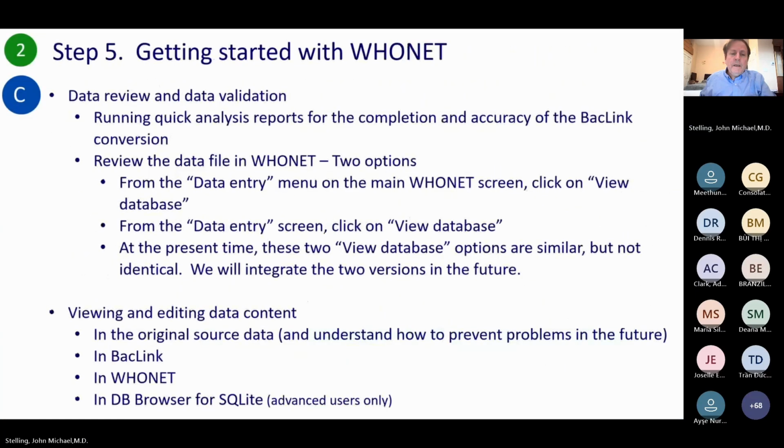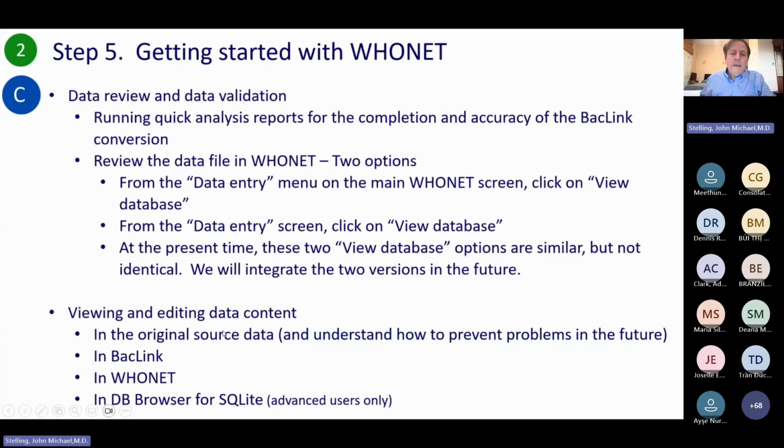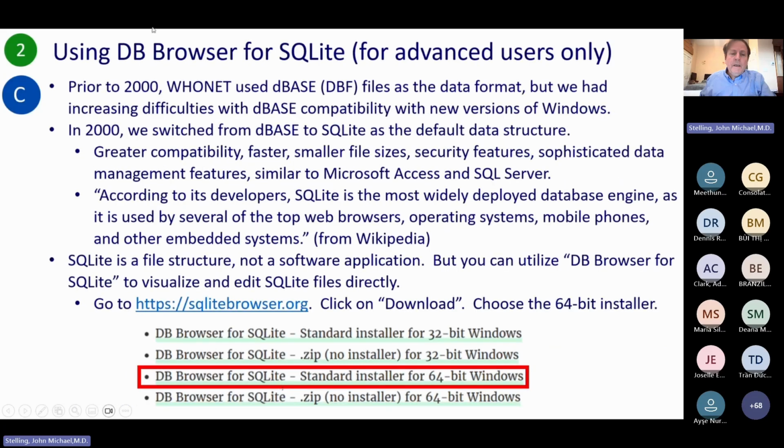Okay. Right. So viewing and editing data. You can do this in the original Excel, in BacLink, in WHONET, or DB Browser for advanced users. Prior to 2000, we used a structure called dBase or DBF, but it gets harder and harder to maintain. When I chose dBase back in 1994, it was already out of date then.